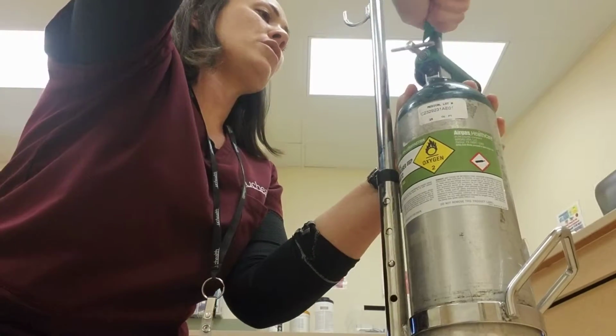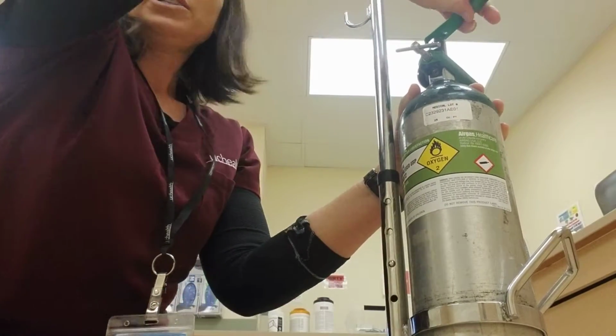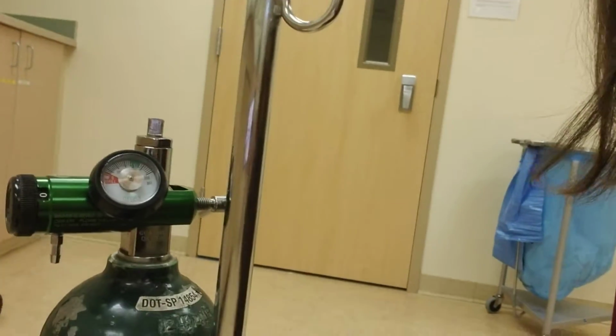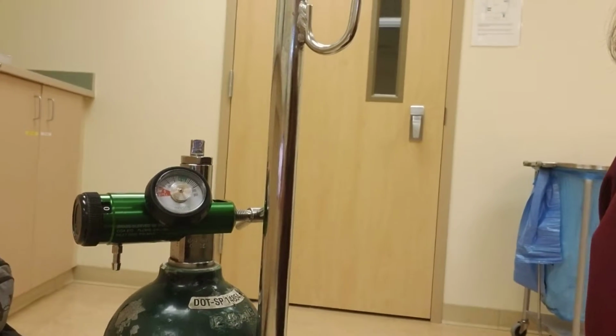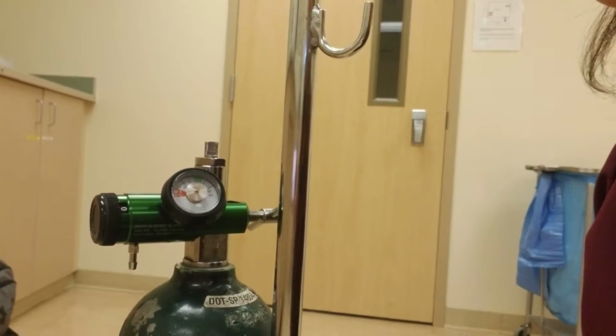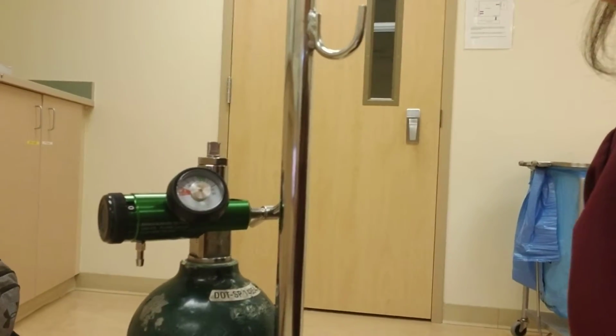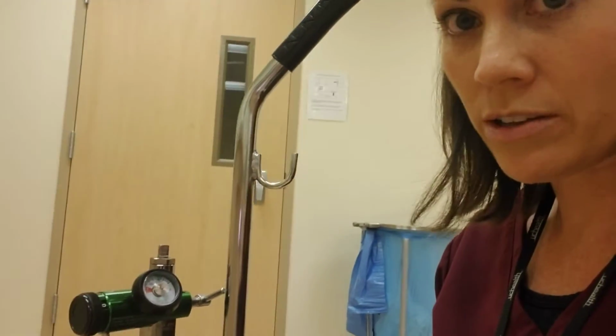We're going to go ahead and turn on our tank here, and we can see that the tank, on the gauge here, the PSI went up to 2,000. So we know that the tank is full. The pressure is at 2,000, and that comes in necessary to see how long this tank will last us.